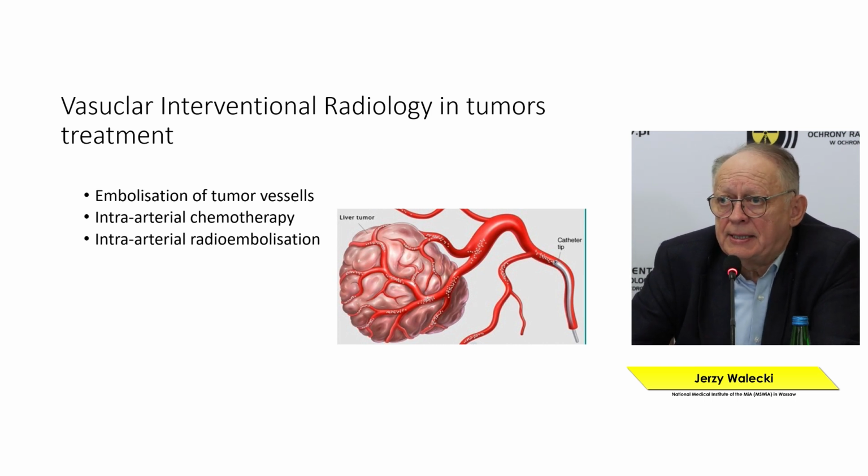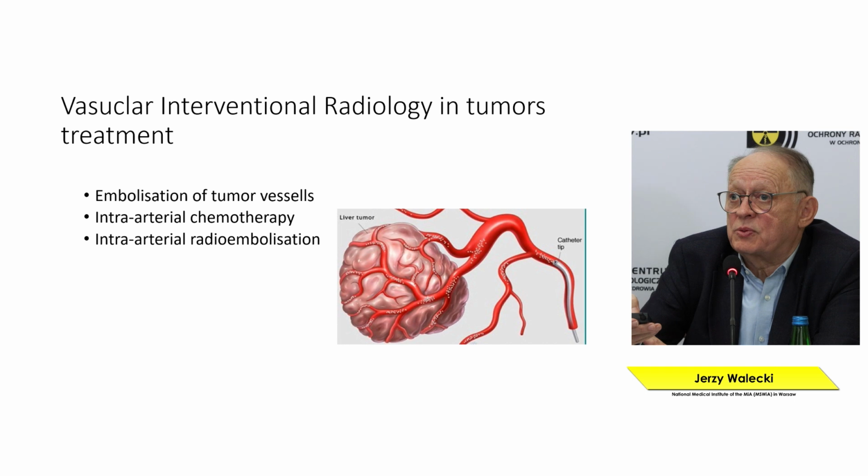Embolization of tumors. This is a new area. Vascular interventional radiology is used increasingly, and the techniques of ablation are also important for oncology, because oncological lesions are related to the high vascularization of such parts.